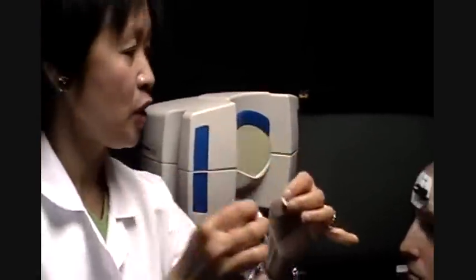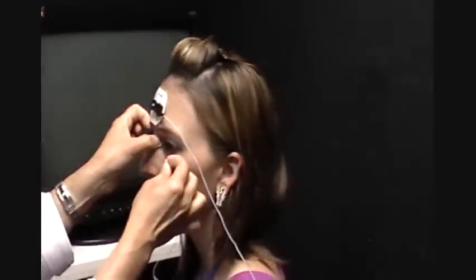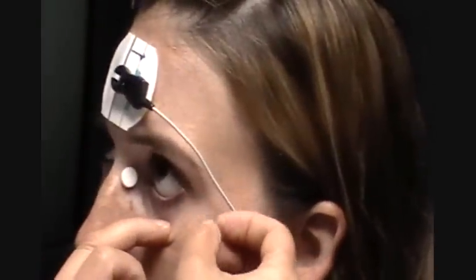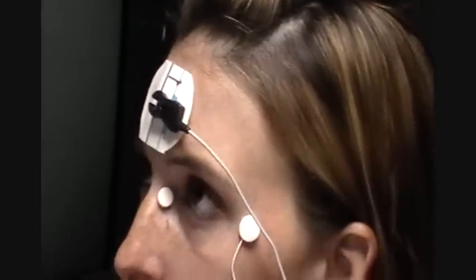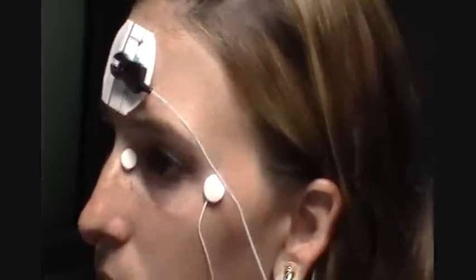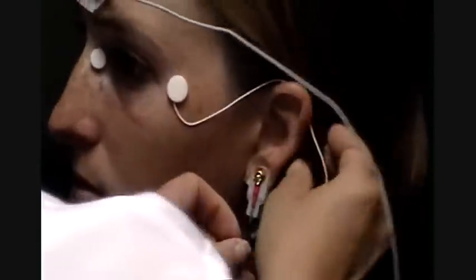We're going to place it here in the inner canthus. Have the patient look up. You lay it right here in the cul-de-sac, a little loose. Now this is hooked up to this cord right here. We hook it right around her ear. She's ready, and we have one more to hook up her other eye.